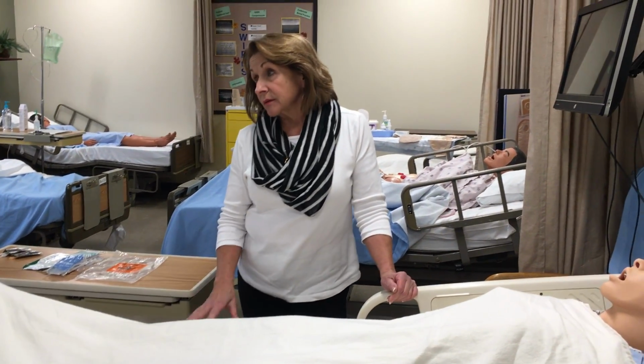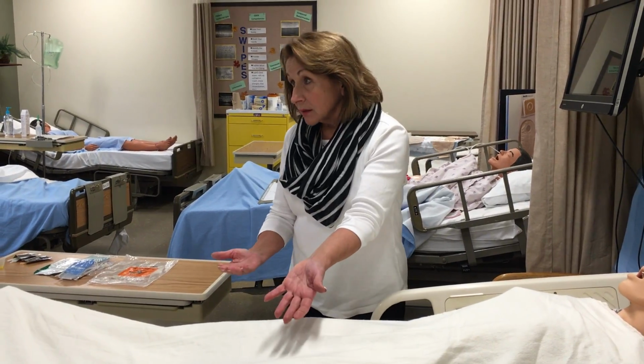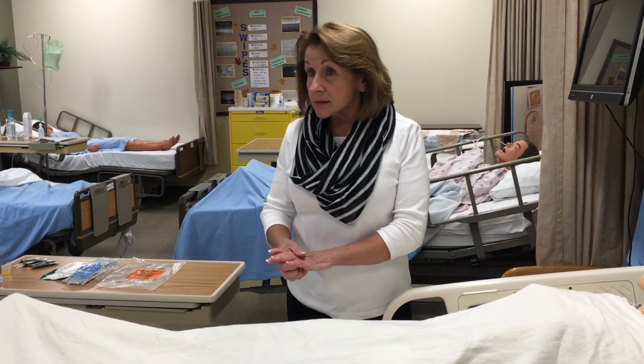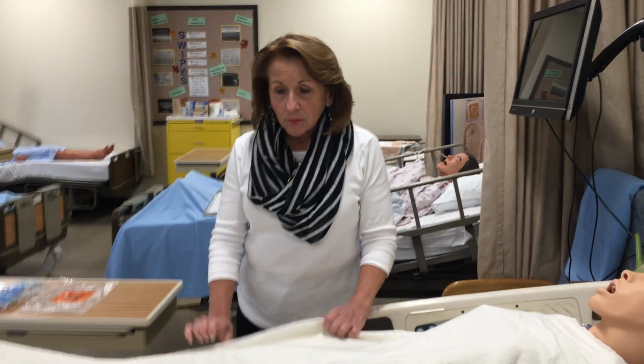Now, depending upon your patient's size, level of consciousness, and physical abilities, you probably won't be doing this alone. You're probably going to need some assistance with supporting the legs. You might need somebody with a flashlight to help you identify where the urinary meatus is. So the likelihood is you'll have a helper for this.